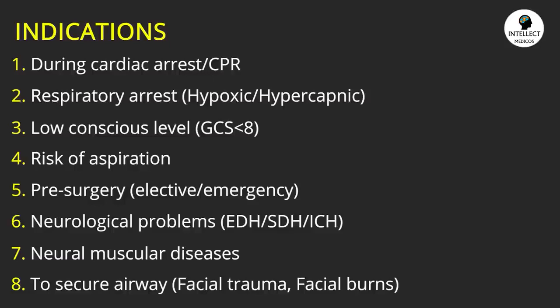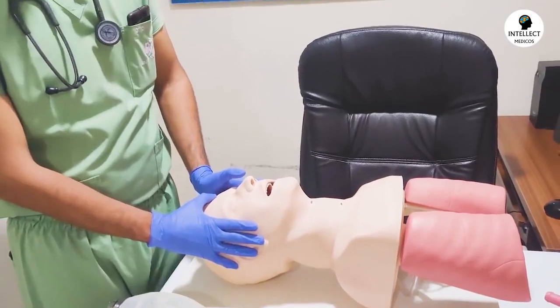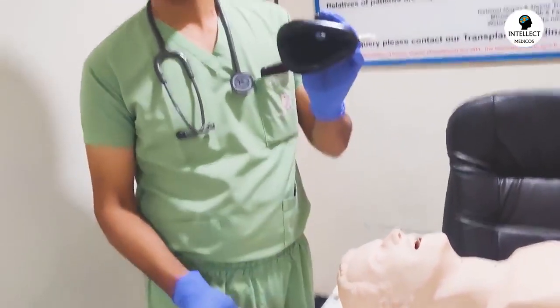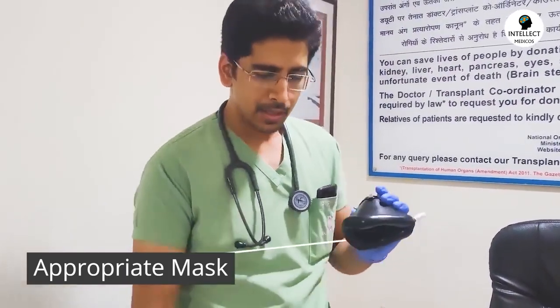Now coming on to the equipment which is required during intubation. First of all, this is our manikin or a dummy on which I will demonstrate the whole procedure. And this is our resuscitation bag. This is the mask. We need to have different sizes of mask.